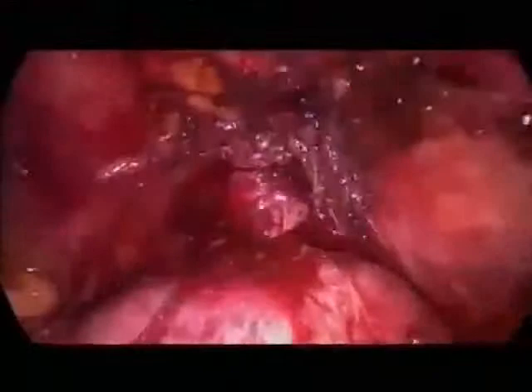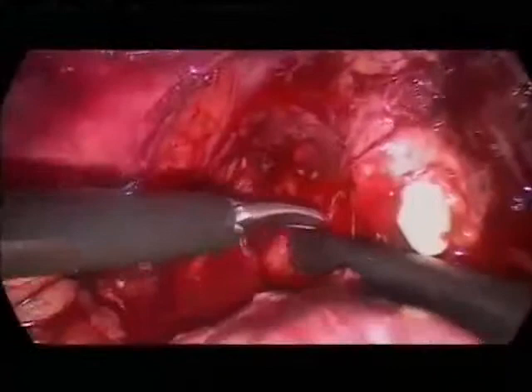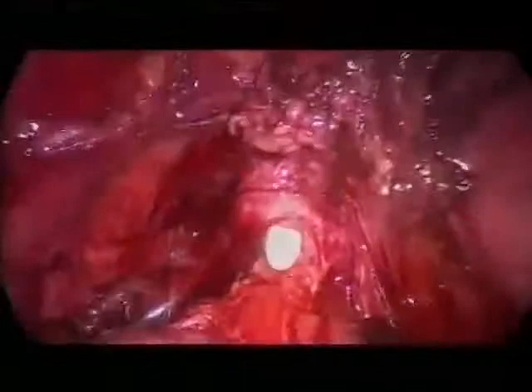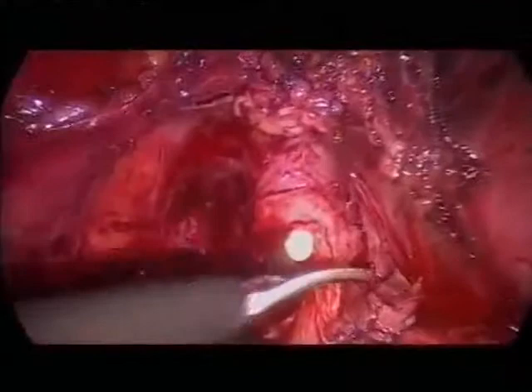Okay, come in. Catheter in, please. A little bit. Cut and lift it up. A little bit in. Stop. So now we have mobilized here on the left side totally the urethra. And you are protecting the rhabdosphincter or the rectourethralis muscle.